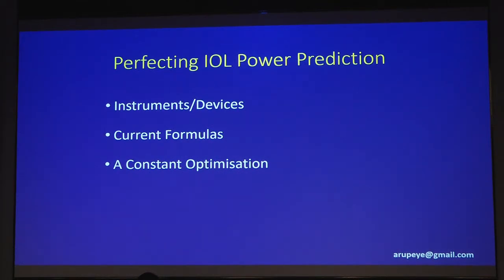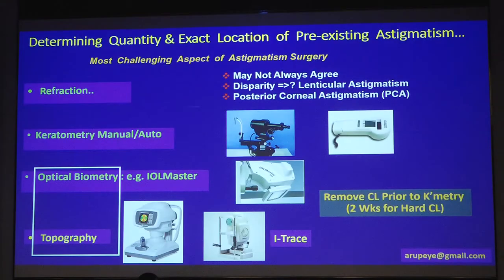The whole thing is, the IOL power calculation field is very dynamic. It's very happening. Every other month some new article comes up. So there are newer instruments and devices. There are formulas which have improved, and the lens constant optimization has also become quite important. Now this is what I do.